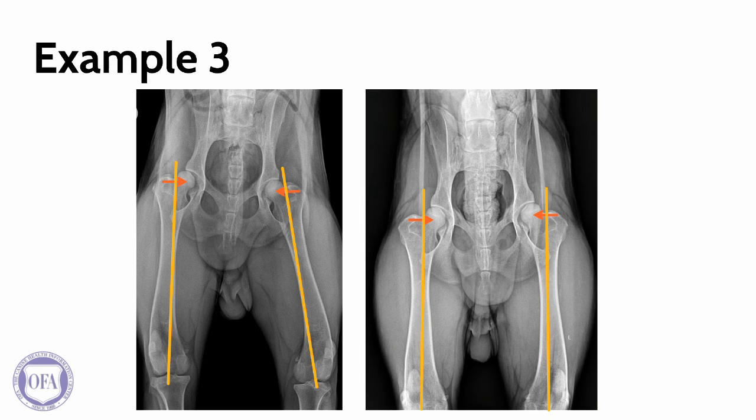On retake images, seen on the right, the ilial wings and obturator foramen are symmetric and well aligned. The pelvic limbs are parallel to one another. The patella remains slightly lateral in position, although improved from the prior image. We can see that this change in position has changed the appearance of that right hip, which now has good coverage of the femoral heads and no evidence of subluxation.